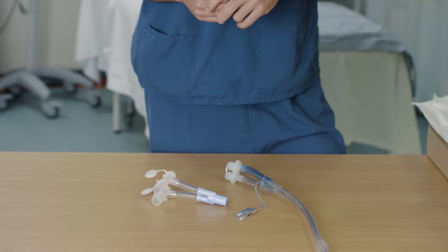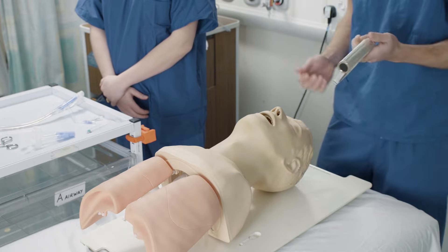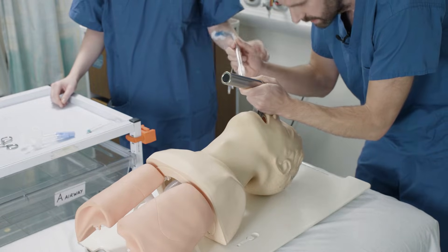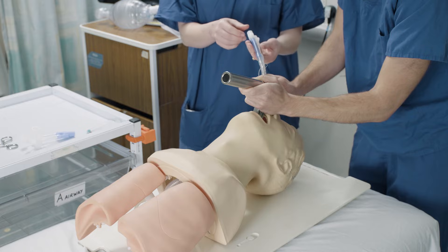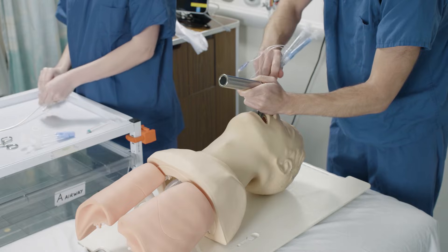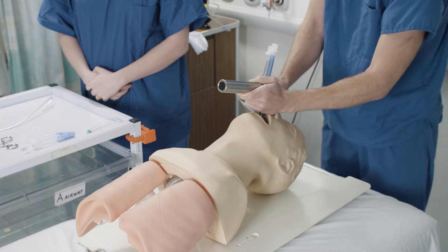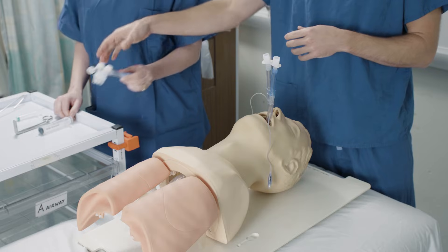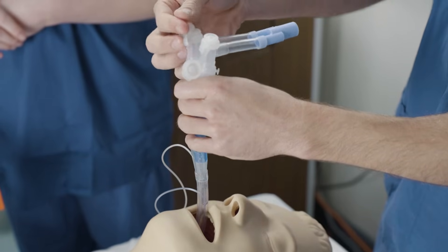You're now ready to insert your double lumen tube. For the purpose of this video I'm using a standard Mach 4 laryngoscope, though in real life we'd suggest using a C-MAC. Go ahead and get a view of the cords. Once the tip is through the cords, ask your anaesthetic assistant to remove the stilette. Then as we advance the tube, we turn through 180 degrees and come back to 90 degrees from where you started, to go through the carina. Now connect the tube using the connector prepared earlier, making sure the top caps are closed.